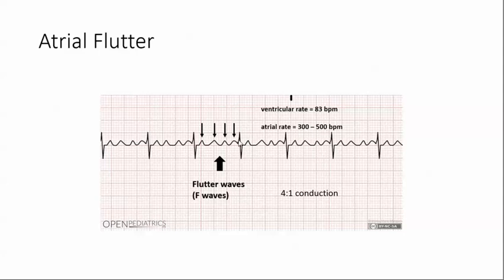You're going to see those flutter waves. Typically they're in a ratio — a 2 to 1, a 3 to 1. As shown here, this one is a 4 to 1 conduction.